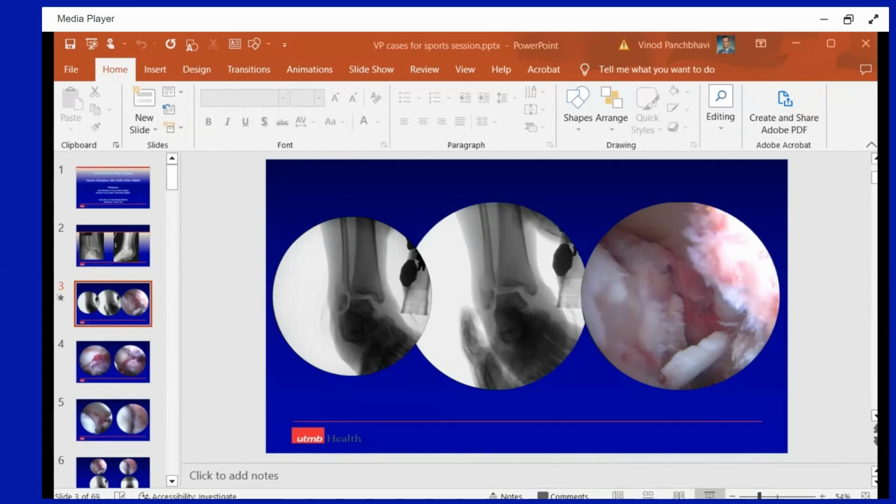And you can see I'm trying to attempt this. I don't know whether you can see my mouse or not, but this is extra-articular. You can see the medial surface of the talus here, and the footprint of the suture anchor over there. And now I don't know whether this video will play. Yeah, see that? That's the stability I have.